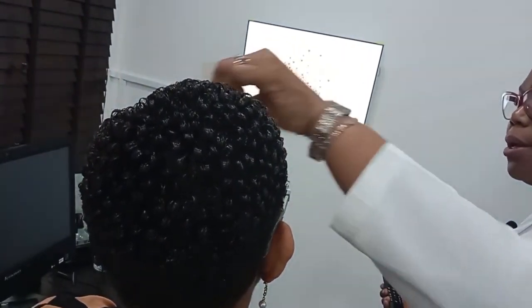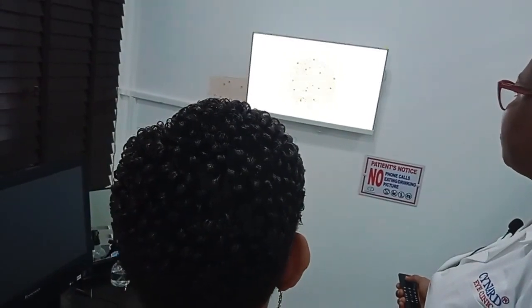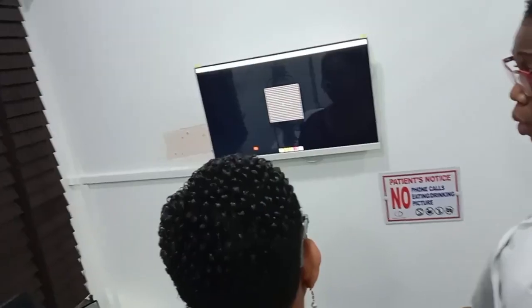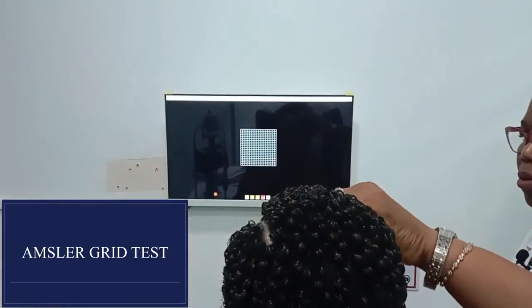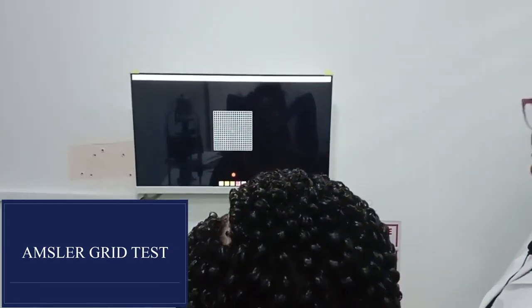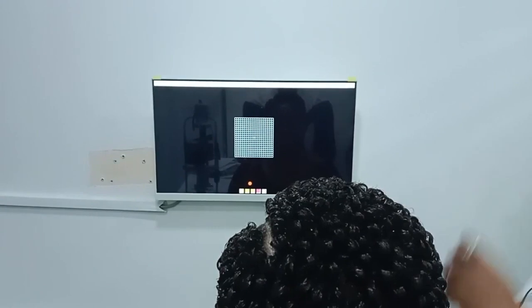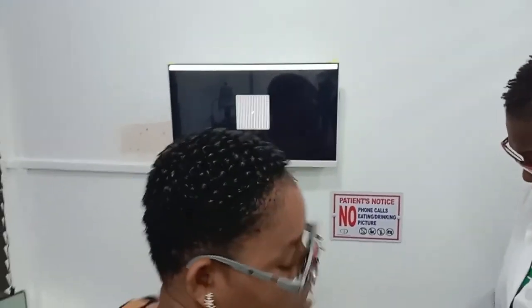The right eye. Let's see. All are straight, no broken lines. Okay. Sorry. What about here? Same thing, no broken lines. And here, no broken lines. That's okay. You can have a seat.